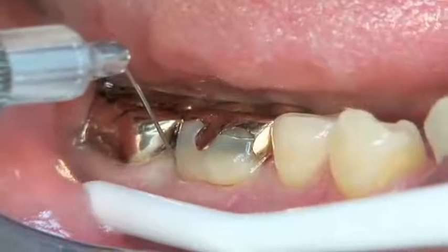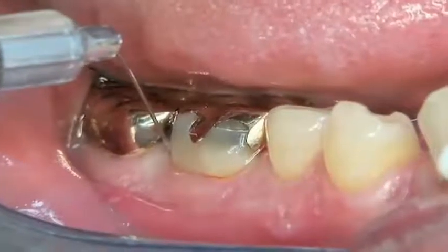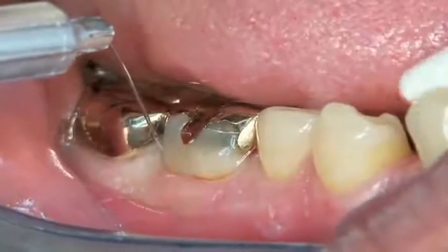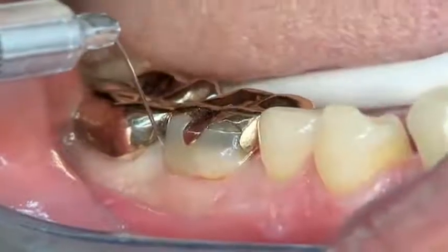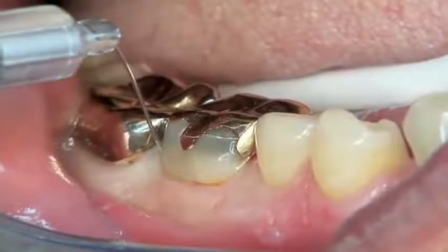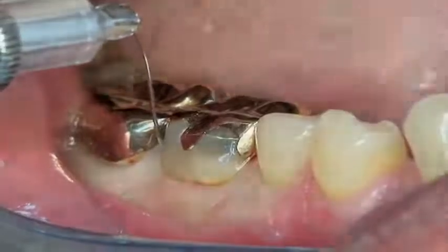This is not a single tooth injection and will frequently anesthetize adjacent teeth. This is a safe injection with relatively little tissue damage. Be sure the patient has safety glasses and that his or her eyes are closed, as carpules have been known to shatter.